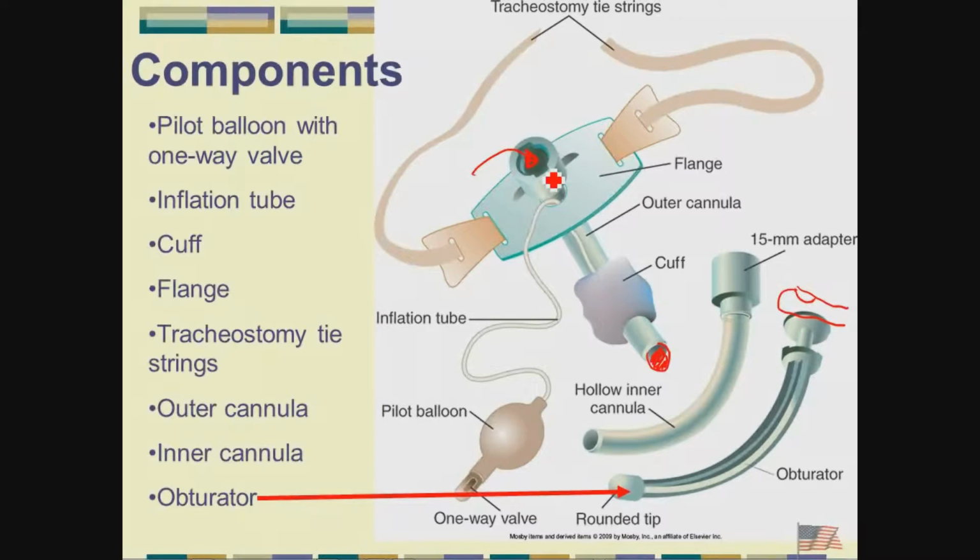Like you said, so why is that even necessary if you already have... This end of the trach is very blunt, and that makes it a little bit more pliable for it to slide into the opening and separate the tissue. Separates the tissue. Otherwise, you would have to make a hole that is awful darn large, that they don't want to. Right, I've seen it done. I guess I never knew that there was a rounded tip.